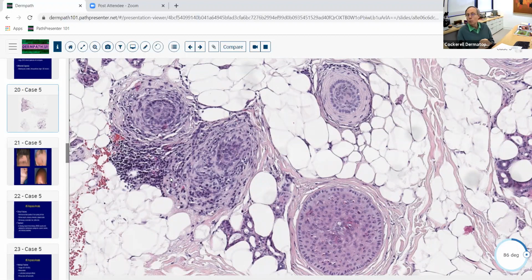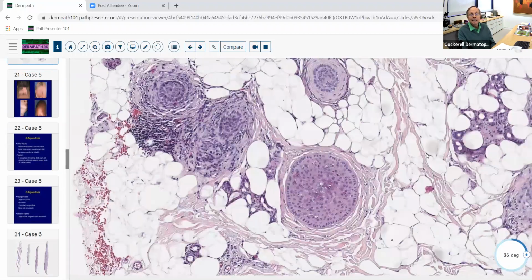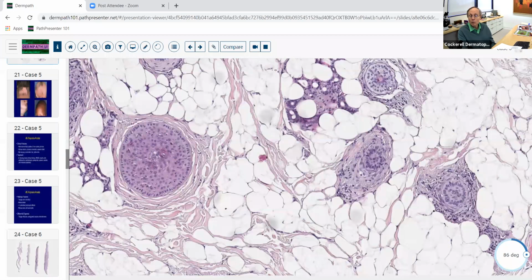So again, these don't read the textbooks, but you've got enough of it here and you don't have anything else that it could be. It couldn't be lichen planopilaris. It doesn't have involvement of the follicles at the right location. There's no scar. You've got the synchronization of the follicles, multiple follicles in catagen. You don't get that in lichen planopilaris. And you've got these follicles here that are in early stages of telogen with a little residual inflammation.